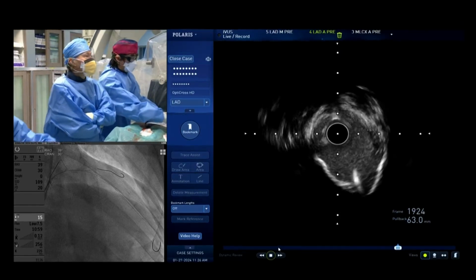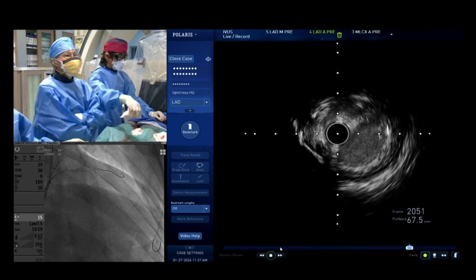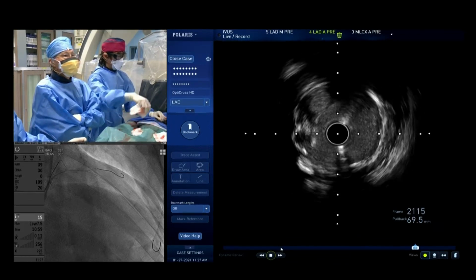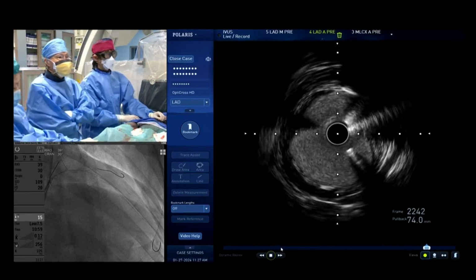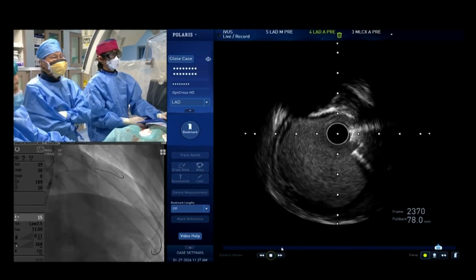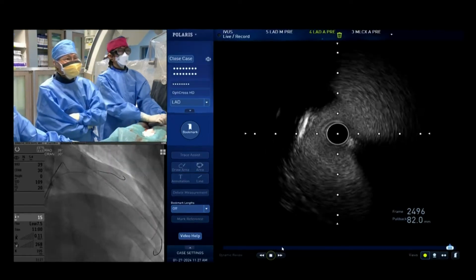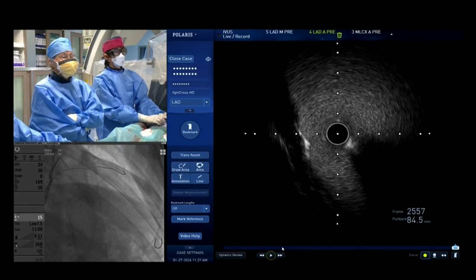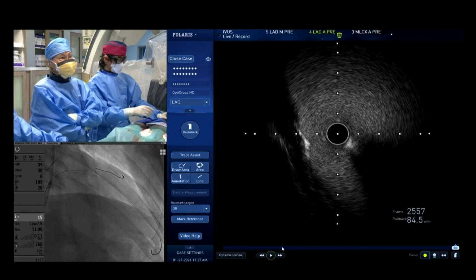Yeah, I think that's what everybody is nodding their heads to. And what sequence will you do? Will you put the stent first or DCB first? So in our mind, we thought it's better to implant the left main stent into the LAD, and because it's a provisional stenting, we need to manage the circumflex as well first, and then at the end, if everything goes well, we would DCB the mid portion.